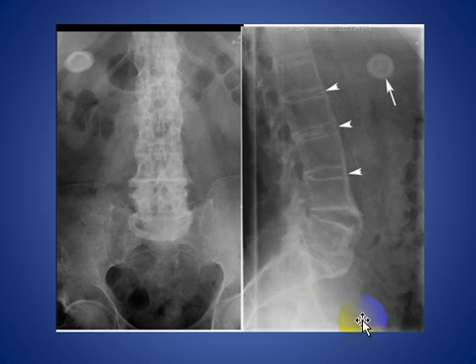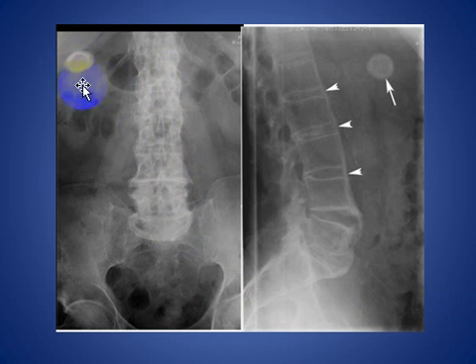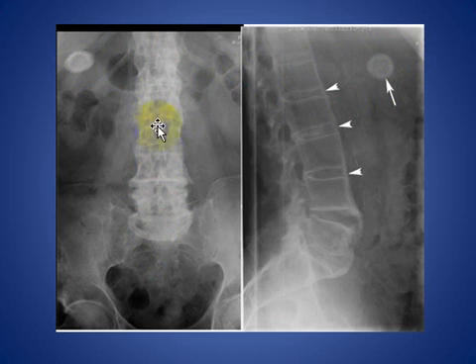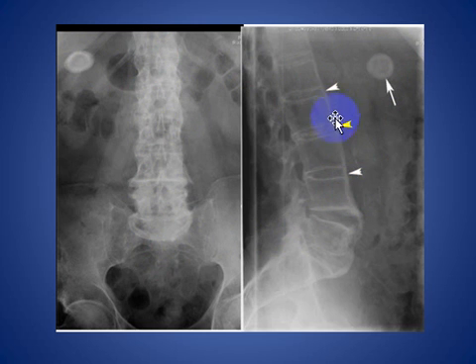Here you see a plain abdomen showing calcification in the right upper quadrant, located anteriorly. This is gallbladder stones with a laminated pattern. Incidentally, there are degenerative disc disease changes involving the dorsal lumbar spine, associated with calcification of the anterior longitudinal ligament, and calcification of the aorta is also seen.